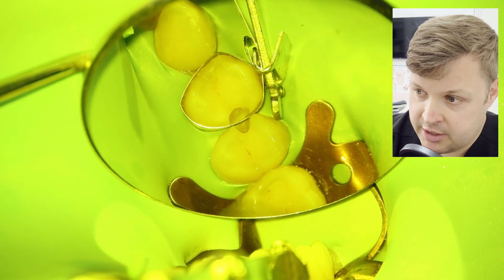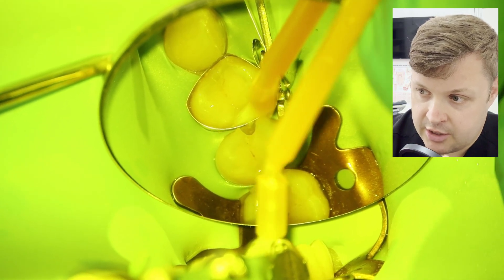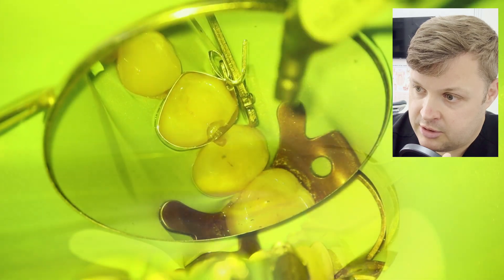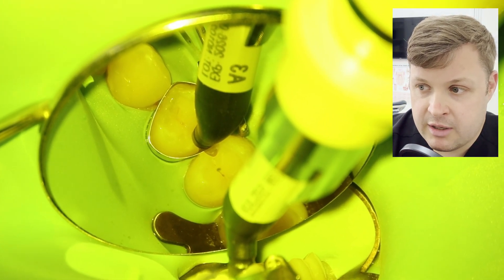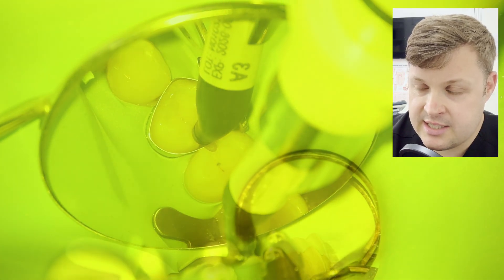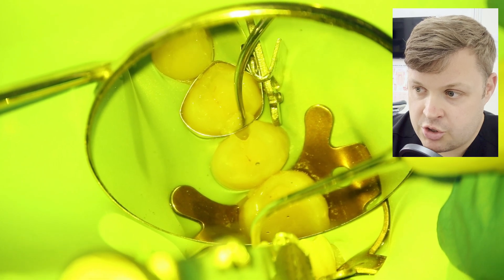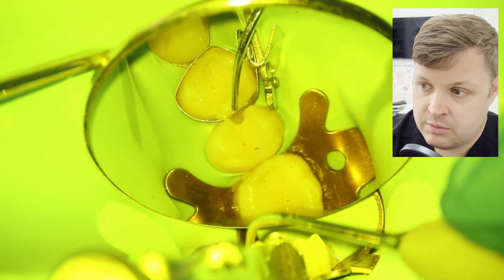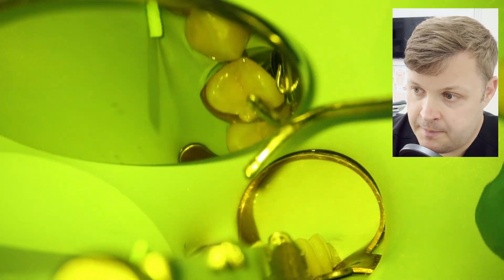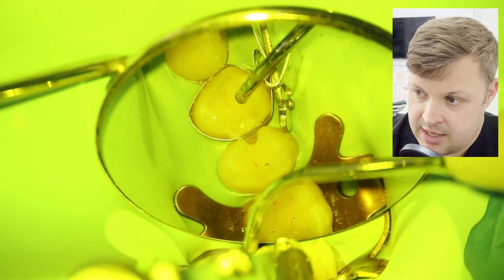Here I'm just etching and bonding the cavity using a normal bonding agent, then light curing. Sometimes I'll use a little flowable in the base of the cavity, but in this case the cavity was small enough to go straight for the capsule composite.